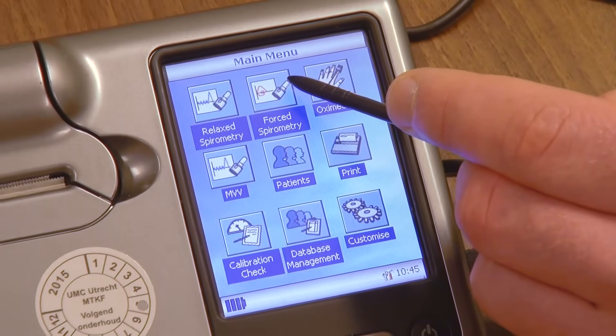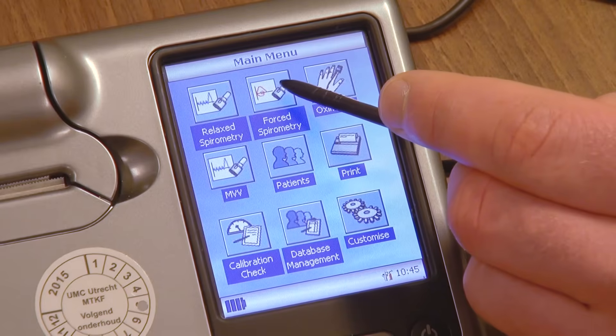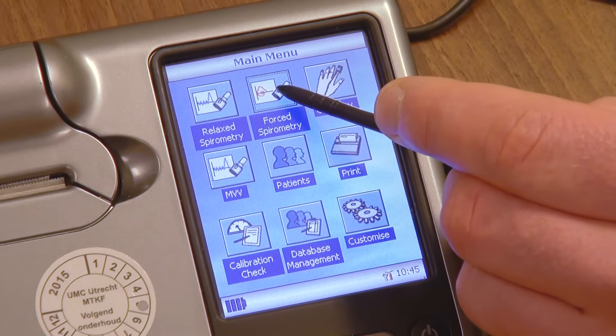Select the test you would like to perform: FVC, shown as forced spirometry.